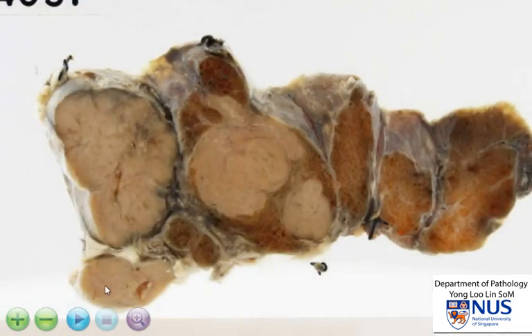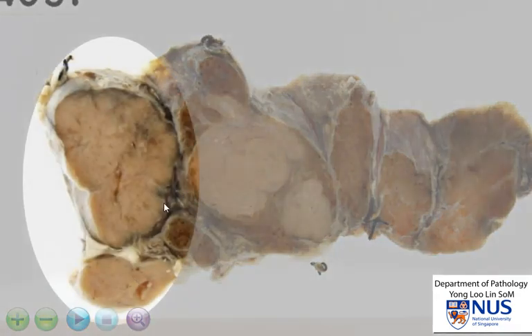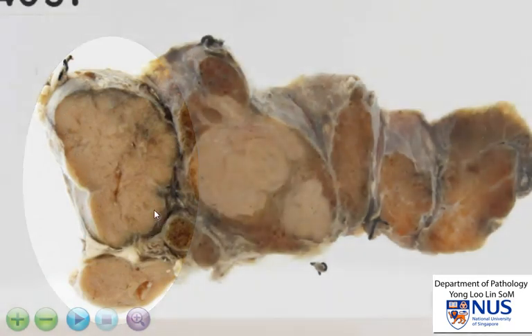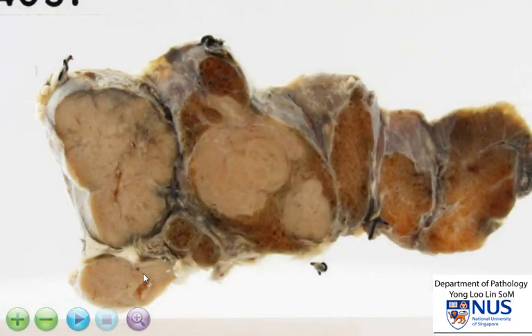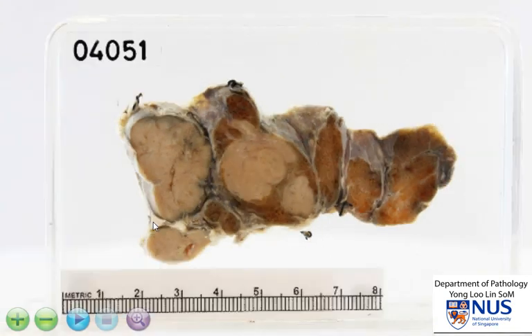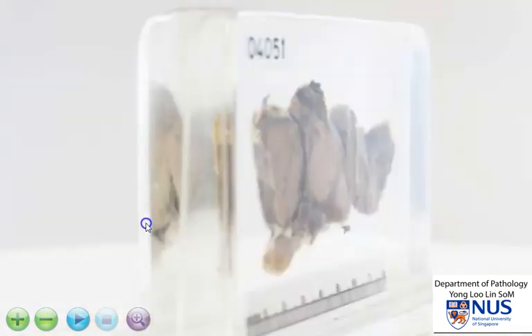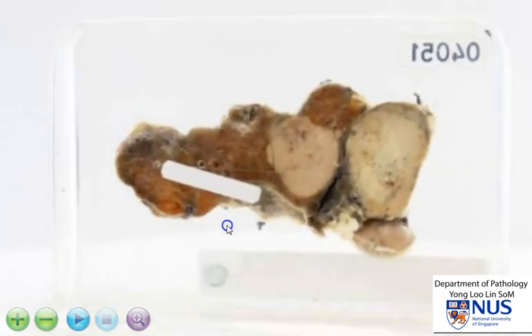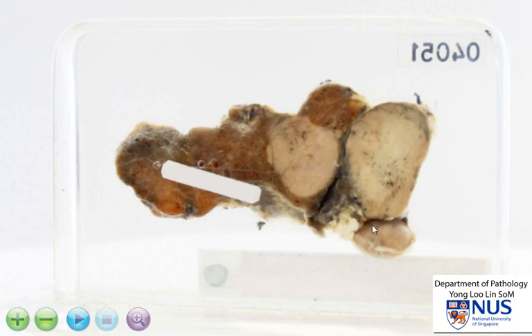In addition, we also see some masses here and here. It is difficult to say for sure whether these are actually part of the thyroid parenchyma, or whether, for example, they are lymph nodes, but what is clear is that they are also involved by the same neoplastic process that we see in the thyroid gland.